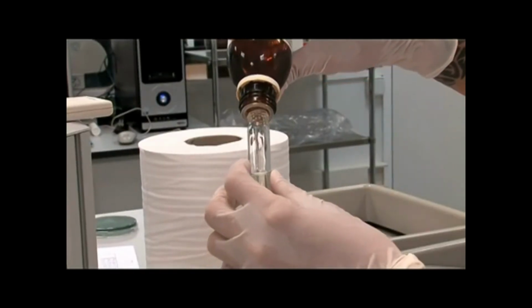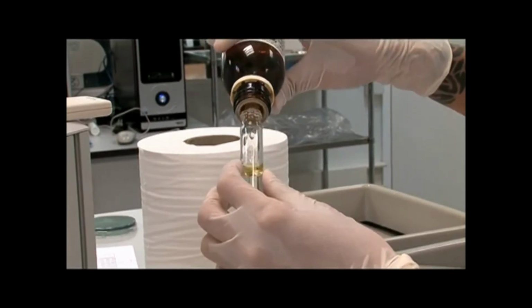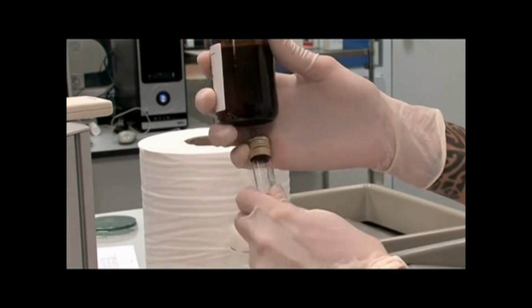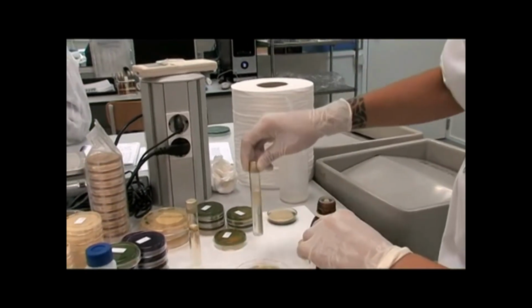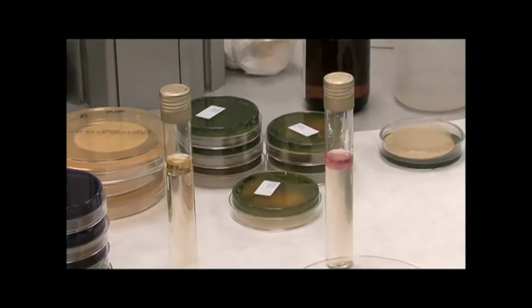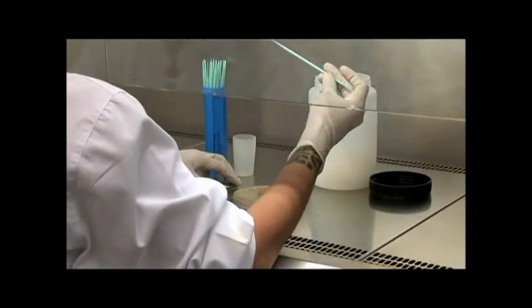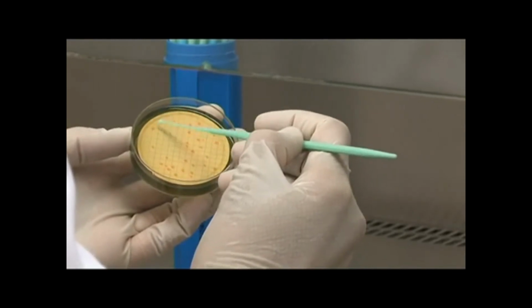Confirmation of E. coli presence is required in the indole test. To confirm the presence of E. coli colonies in this medium, a small amount of tryptophan is added. To verify the production of indole, coat the blue-violet colonies with a drop of Kovacs reagent, art. number 618. If the reagent turns to a cherry red color in a few seconds, positive production of indole confirms the presence of E. coli.